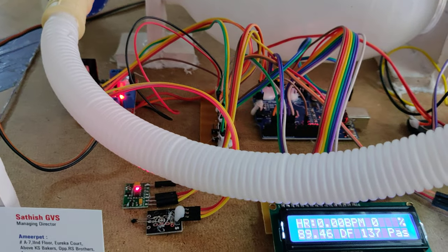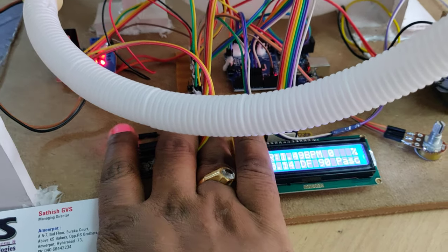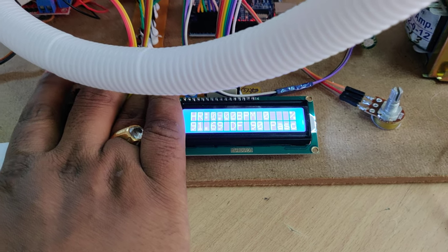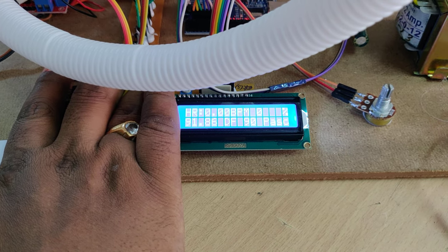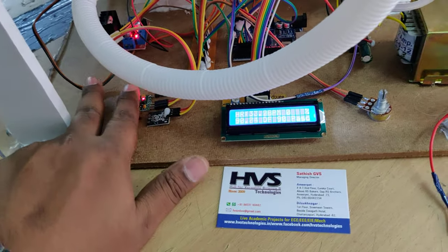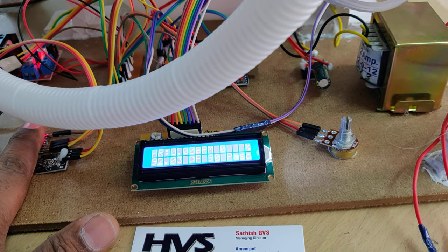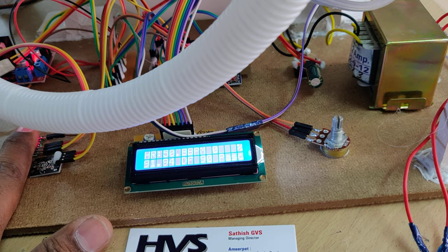Now make it zero first, and let us go with the input from the sensor. Just place the finger as I have shown, in this manner. The readings will stabilize. Once you get the proper readings, you will get the proper heart rate and SpO2 details directly. Let us place it in this manner. When you get the SpO2 value, only then will it be considered as proper values of your health related parameters.